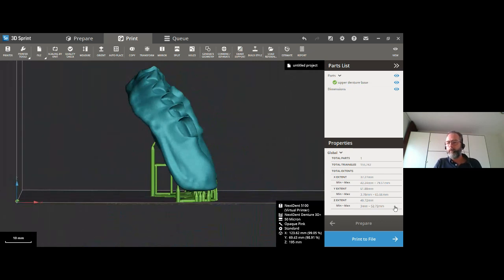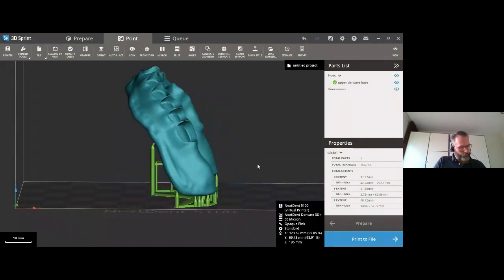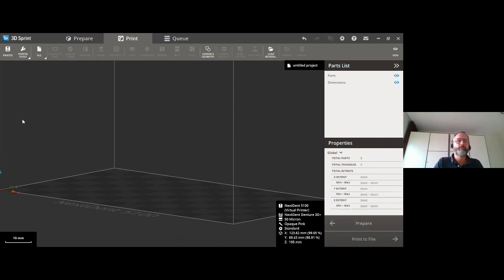Okay, normally now it would be time for Q&A, but I understand that there are at the moment no questions. Is this correct? Yes, thank you, Menno. Well, there are no questions in the Q&A of this webinar, probably because there are some technical problems with it. I received one question over the Facebook post, and that has to do with the position and orientation of the models when we import them. They are in the 0 point or not inside the platform. Maybe you can comment on that a little bit. Why is that, and is this something that will change in the future?